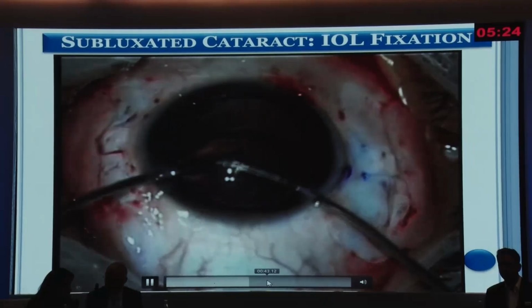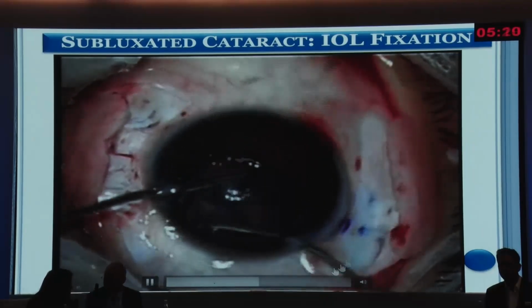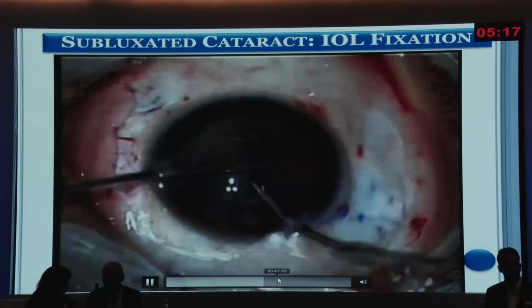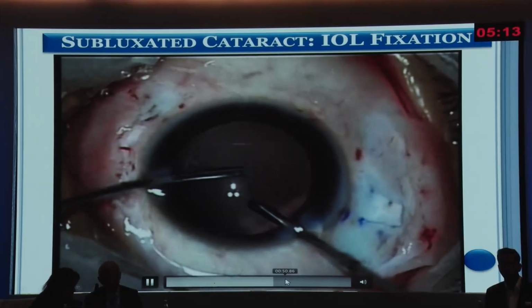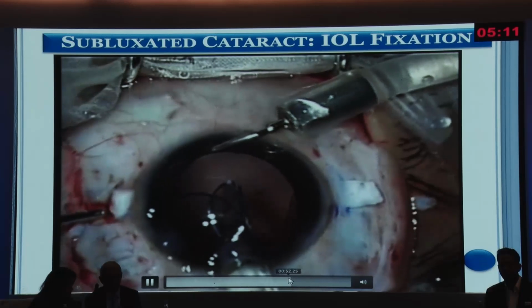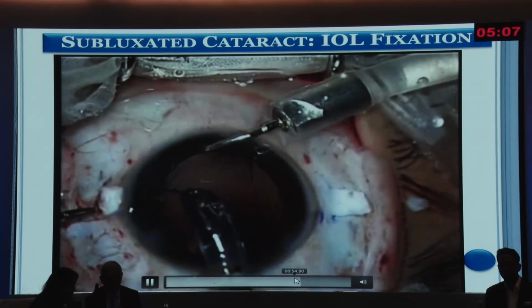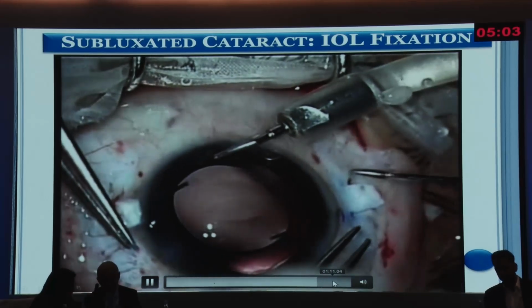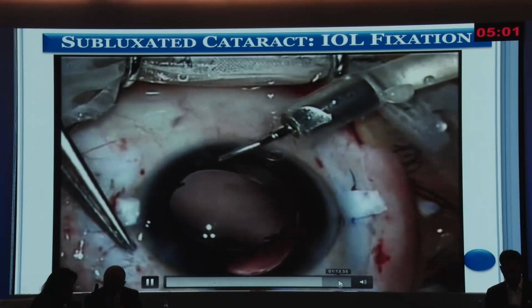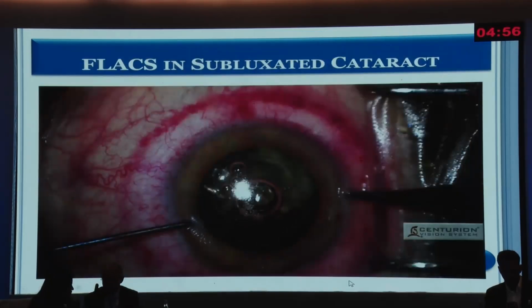Then, using intralenticular lens aspiration, the technique that was described by us in 2005 in JCRS, we complete the procedure, and then a multi-piece IOL is introduced and the tip of the haptic is held with a lens fixing forceps and exteriorized on one side, and then exteriorized on the other side as well. The haptics are then tucked and glue is used to stick them.